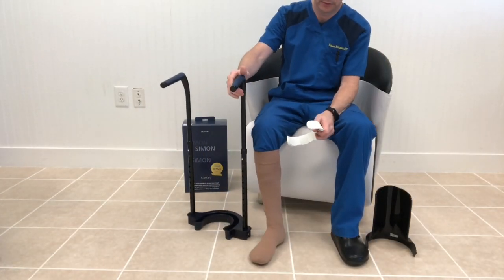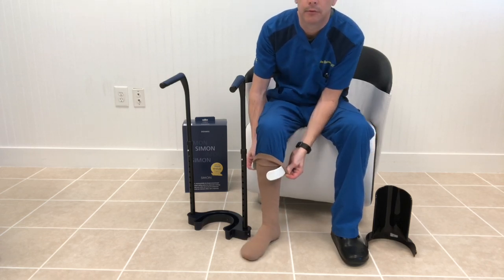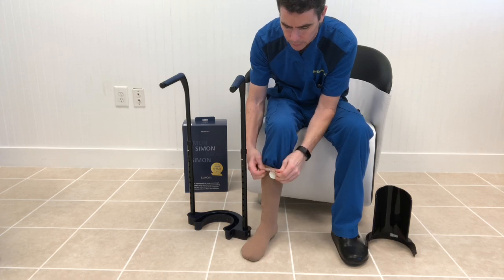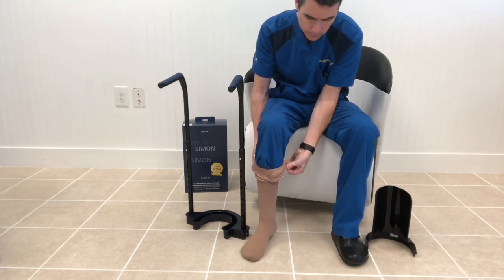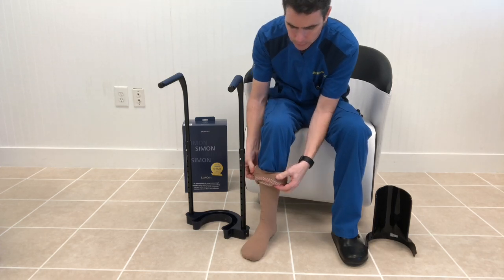So we're going to show an alternative way to load the ring. In the previous example, I put the ring inside up against the skin. Now I'm putting it on top of the compression sock and folding the top edge over. You can try both and see which works best for you.